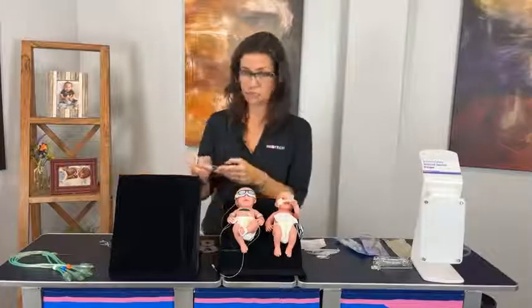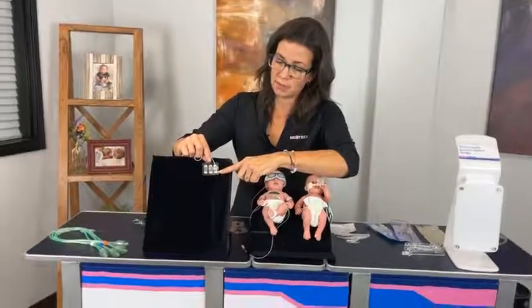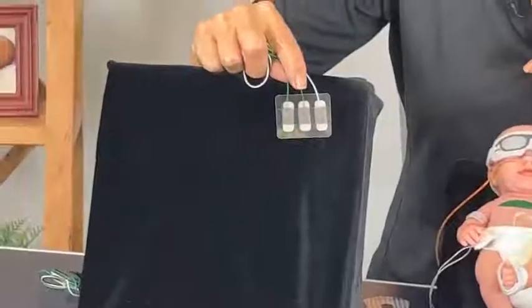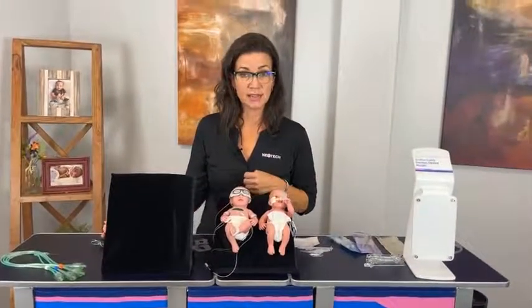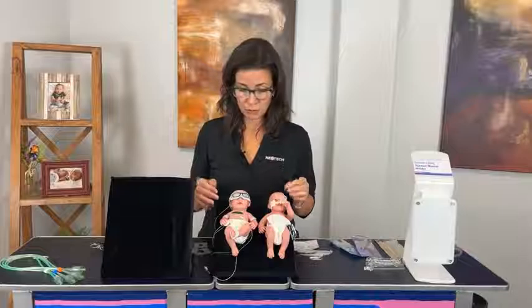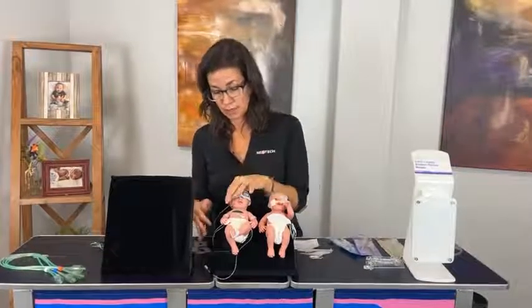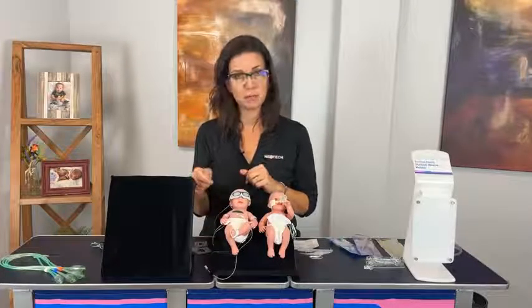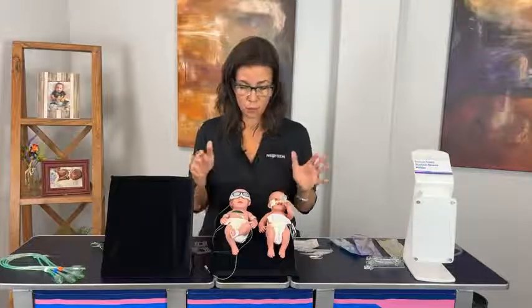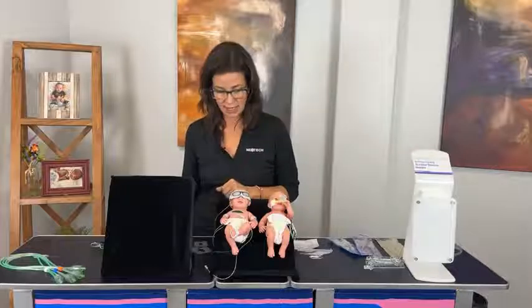I'll show you. Application process for these is the same. I'll show you the hydrocolloid is on the ends of these. And you would also warm these prior to applying. Hold them in place for 60 seconds. And then when it comes time for removal, you want to remove with water or saline. So you would saturate the product and then gently roll away the product from the skin as you continually swab with water or saline. Once hydrocolloid has been removed, you cannot reapply it, so you need to grab another set.